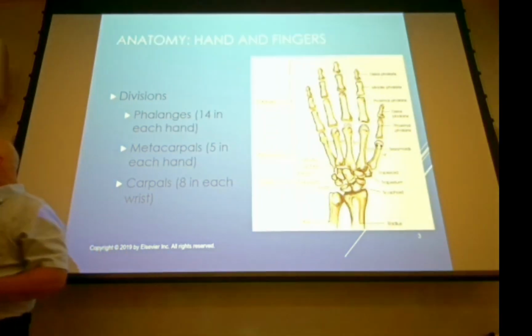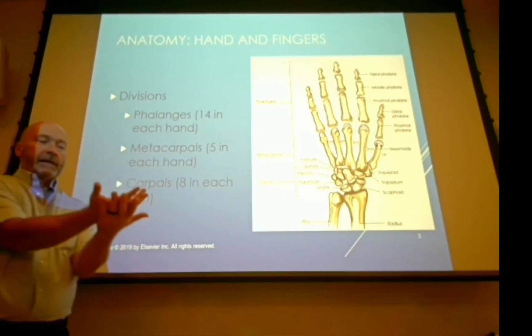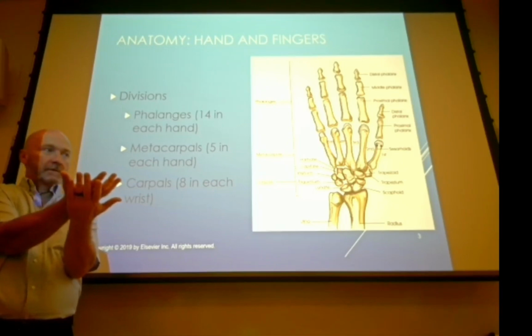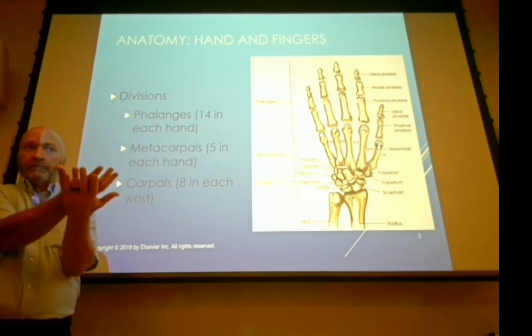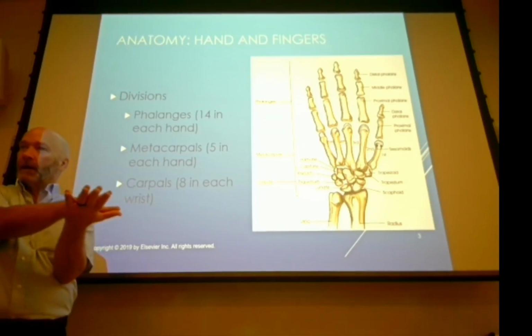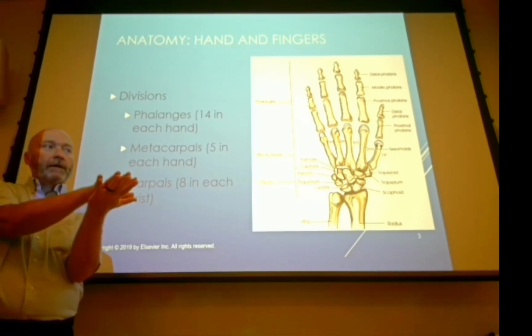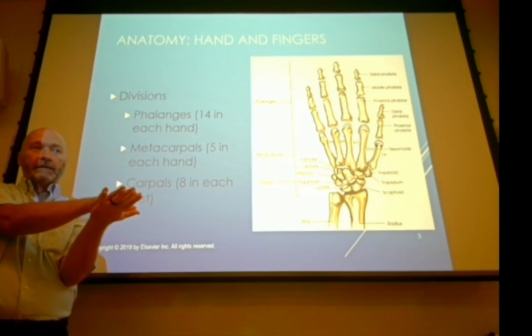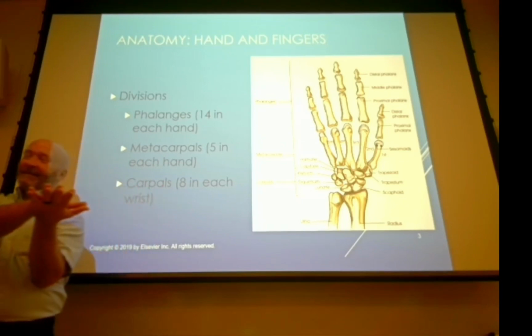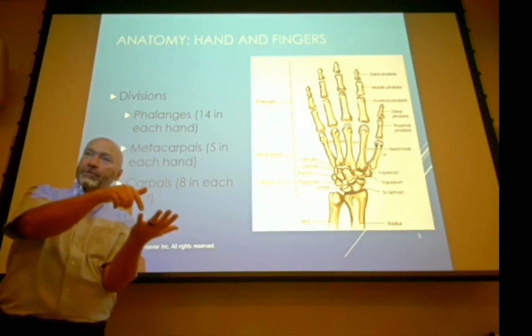Okay. So if you tell your patient, I want you to put your hand on this thing, and they put their hand out like this, how are their fingers most likely going to be? Slightly bent, right? It's most comfortable for them. That's an awkward position to be in. But if you flip the patient's hand around, what happens? It flattens out, right? So in that way, what position are we going to put the patient's hand in? This projection, you're going to struggle with that. That's okay. Prone, exactly. It's going to be pronated, PA projection.